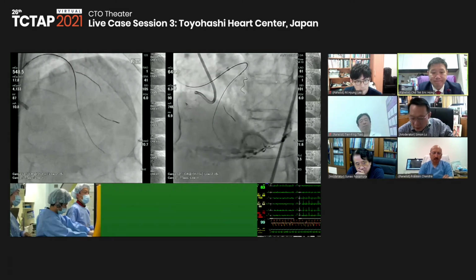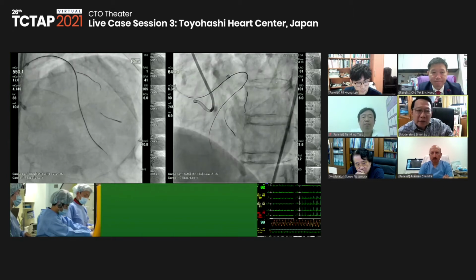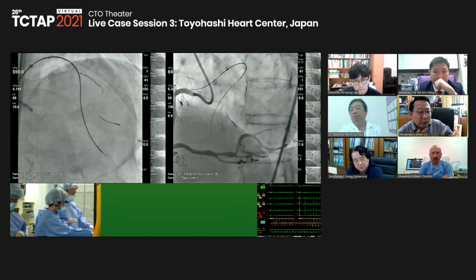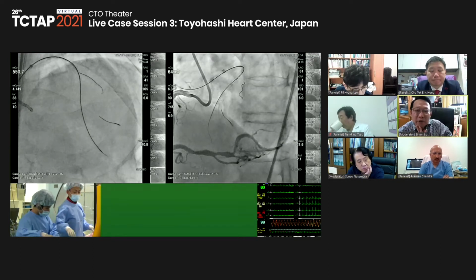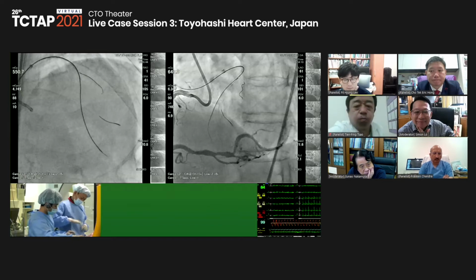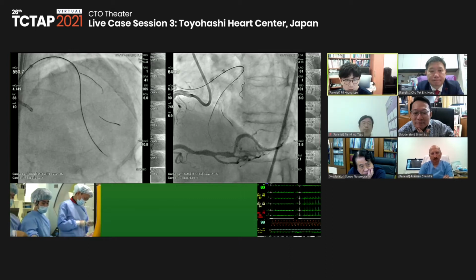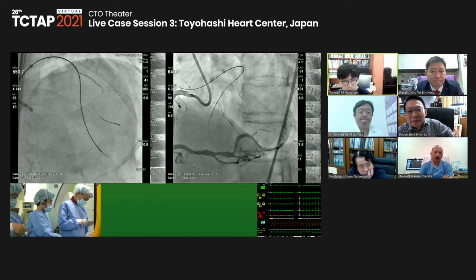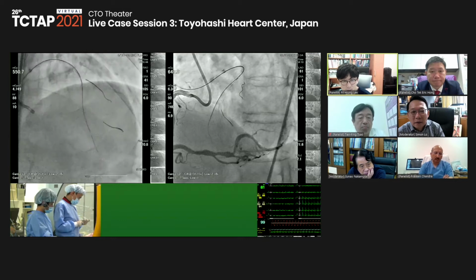Dr. Lee, would you do the diagonal dilatation first and then perhaps consider doing a DCB into the diagonal before you stent the LAD? Well, my practice in this kind of lesion, considering the baseline angiographic morphology regarding the angle of the diagonal and the disease at the ostium, I would not do any pre-dilation of the diagonal ostium.